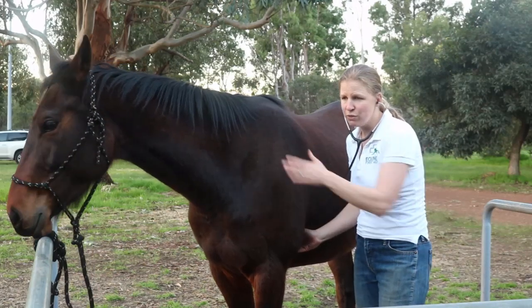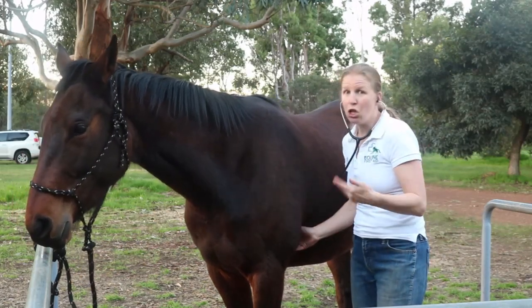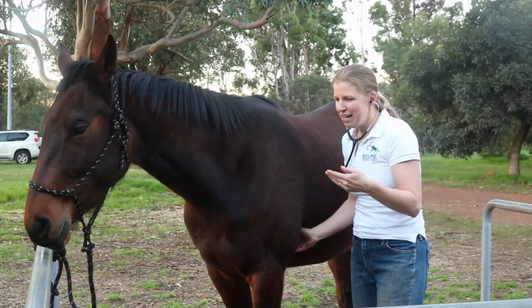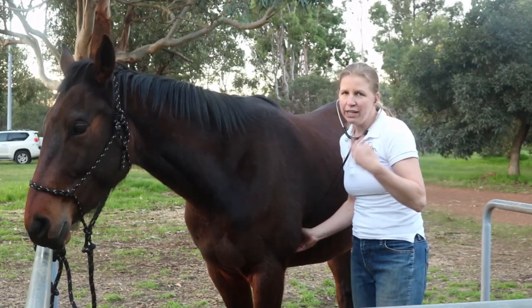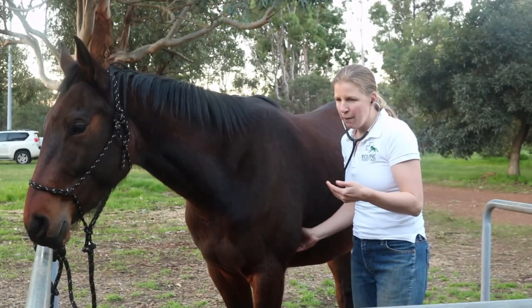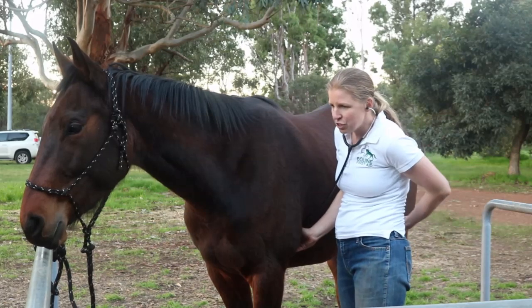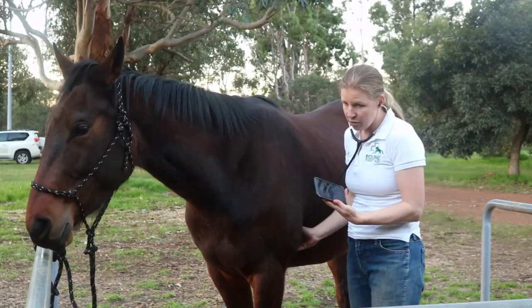The horse's heartbeat is in two — lub-dub — just like a human's, but because the horse's heart is bigger, it is slower. So it's easy to mistake it for separate beats. You do need to listen for a little while and get used to that rhythm: lub-dub, lub-dub.